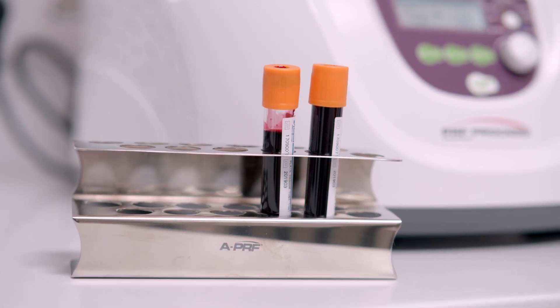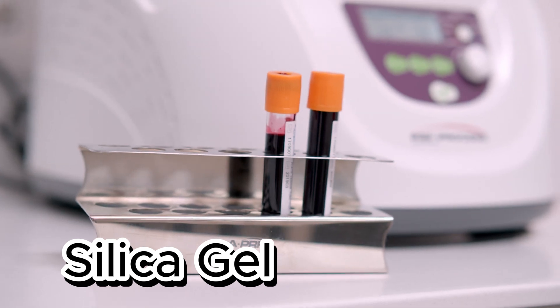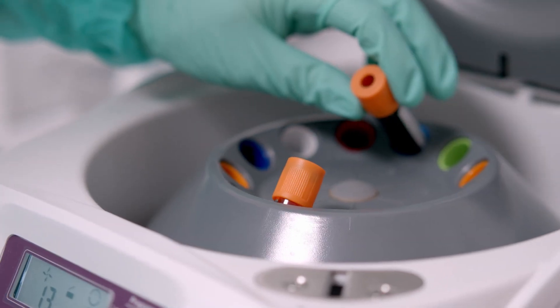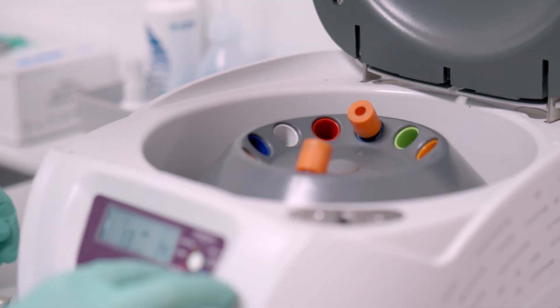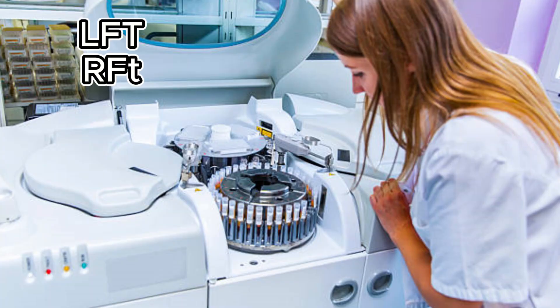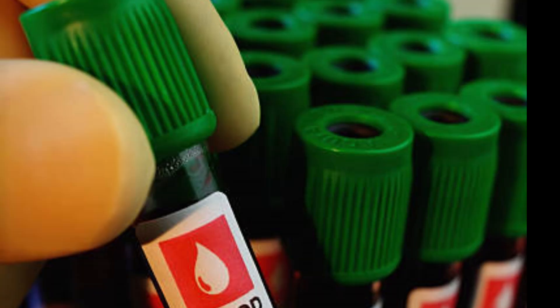Now the fancy one — the gold or tiger top tube. This one has a gel separator plus clot activator. When blood is spun in a centrifuge, the gel helps separate serum from cells. These tubes are super common for tests like hormones, liver function, kidney function, and other biochemistry panels.